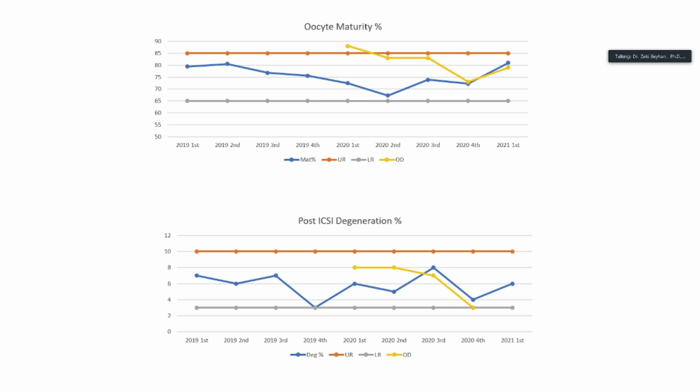In terms of those KPIs in the lab, the KPIs we are using pretty much overlap with what is suggested in the literature, and these are basically defined by ASRM, and then later in the Fertility and Sterility papers. These are the data according to our understanding as well. It makes a lot of sense. Here, let me give you a little information about the charts.